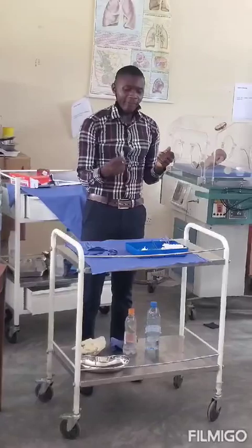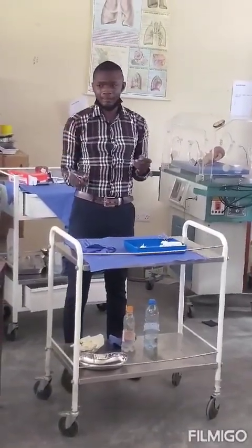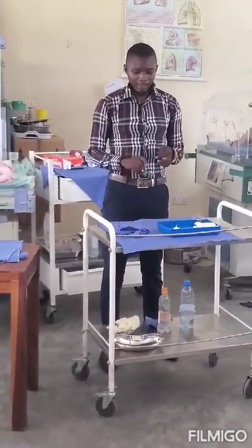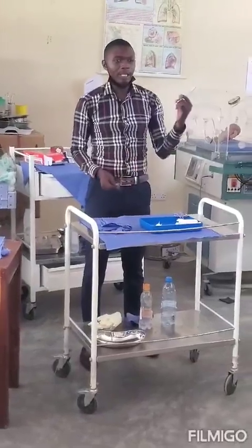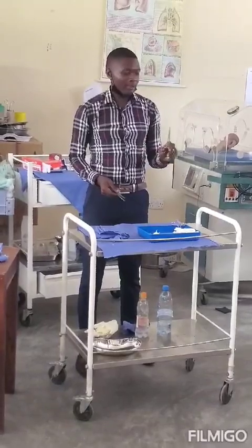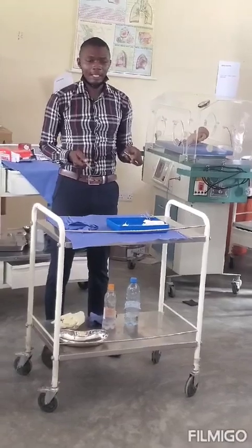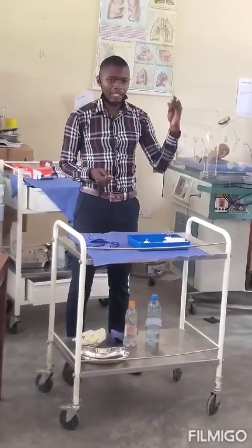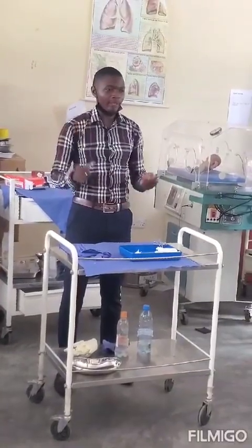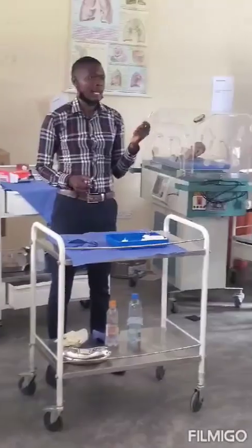So at this point, the first thing that you do, pick the artery forceps and the dissecting forceps. If you are left-handed, put the artery forceps on your left hand because you are left-handed. But most of you have difficulties using this forceps on your left hand because you are not used to it. That's why I've always said, let this be on your dominant hand, because this is the working forceps, this is just the picking forceps. That's why it's always on your left hand.